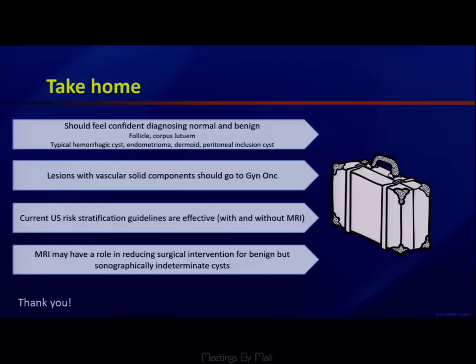So feel comfortable diagnosing normal and benign. Know that lesions with a vascular component go to gyn-onc. Our current ultrasound risk stratification guidelines are effective both with and without MRI, but MRI may have a role in reducing surgical intervention for the benign but sonographically indeterminate cysts.